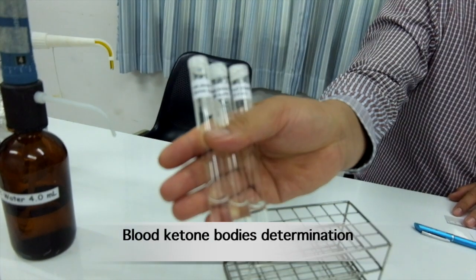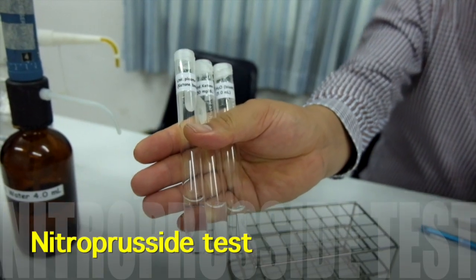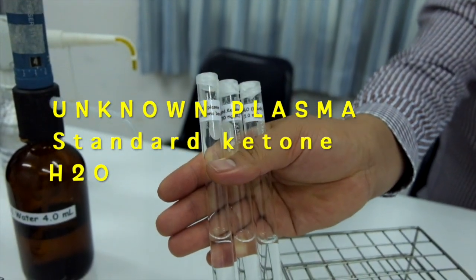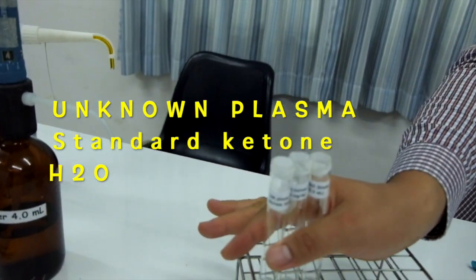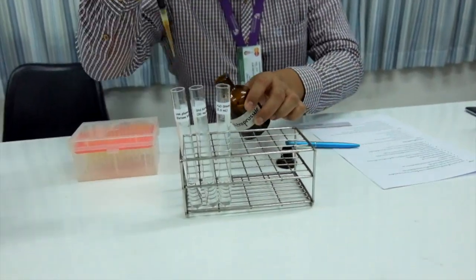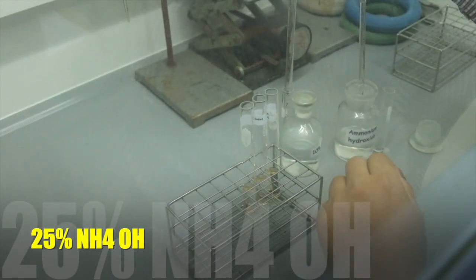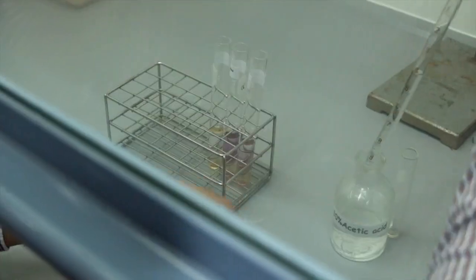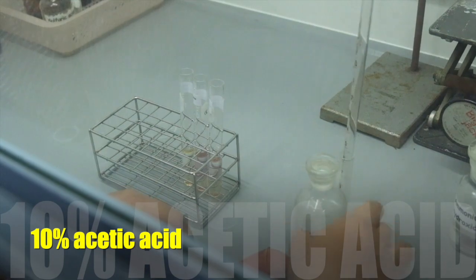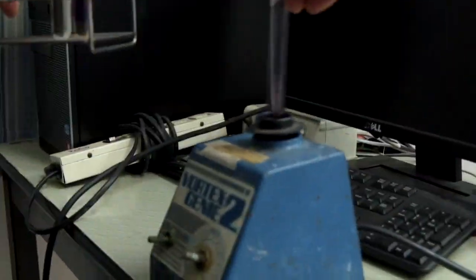Determination of ketone bodies in blood. In order to perform ketone bodies determination, the nitroprusside method is implemented. You receive 3 test tubes containing 5 ml of unknown plasma, standard ketone bodies, and distilled water. Add 200 microliters of 5% nitroprusside solution into all test tubes. Then add 2 ml of 25% ammonium hydroxide solution into all test tubes in the fume hood. Next, add another 2 ml of 10% acetic acid solution in all tubes. Mix well with a vortex mixer.